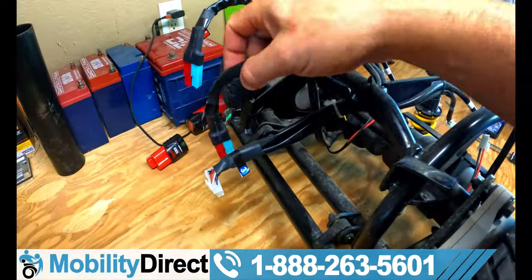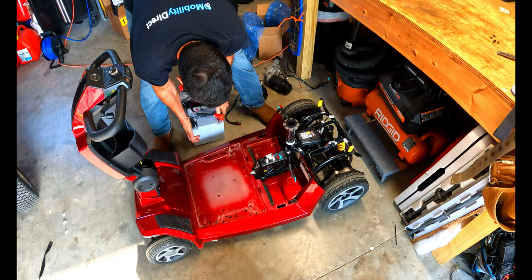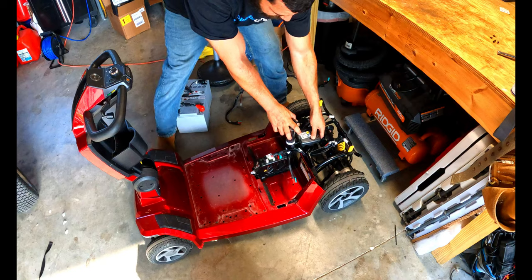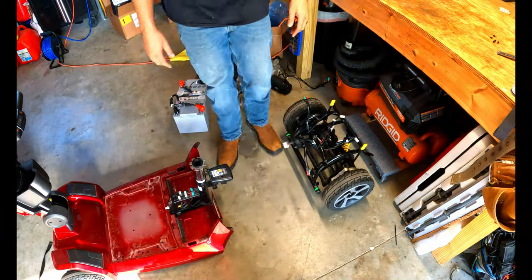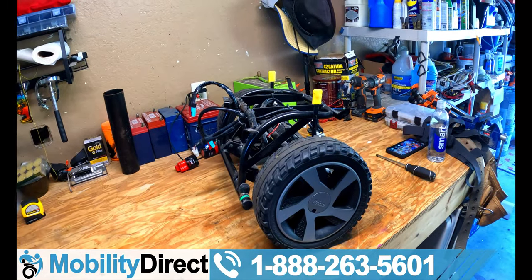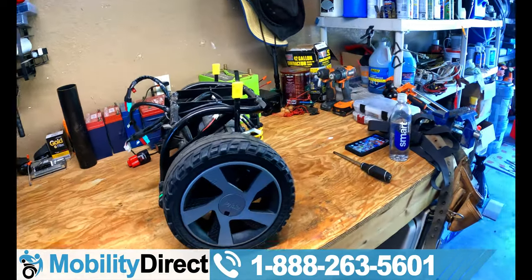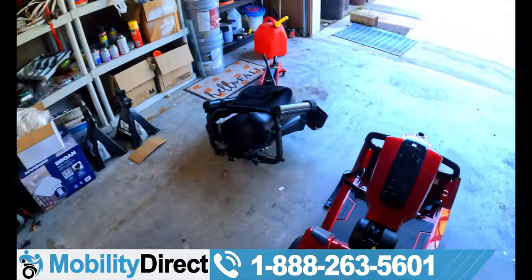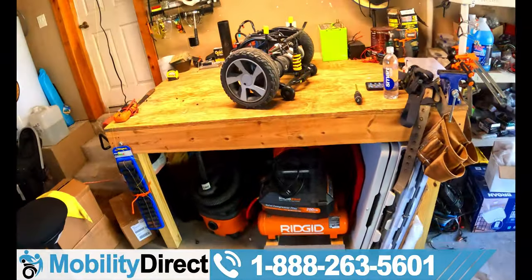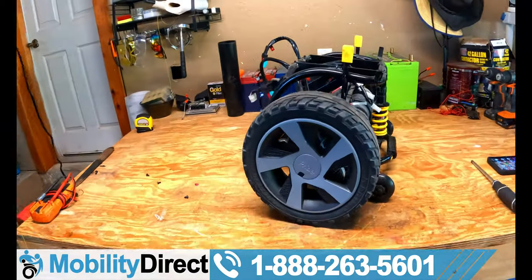You can break this scooter down into about five to six pieces including the batteries. When you take it apart, you'll want to work with the rear half detached from the front half. So the front half is right here and we already took it apart. I'm going to mount my camera back up and move forward — the next step is to remove the tires.